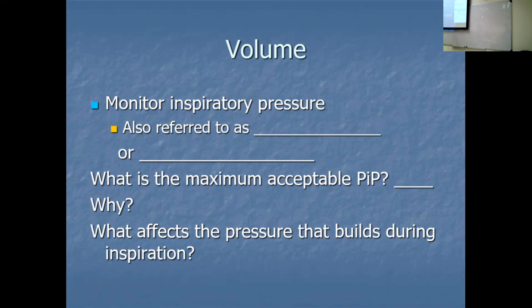What affects the alveoli is when the plateau pressures are higher than 30 centimeters of water. And not 30 to 40, there's no range. If you do a plateau pressure and it's higher than 30 centimeters of water, something needs to be done at that point. Either a smaller tidal volume, or change over to pressure control. You don't continue ventilating with the same tidal volume if your plateau pressures are higher than 30 centimeters of water. You're damaging the alveoli.